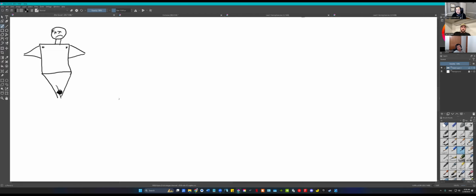So we're only looking at the limb leads now. As far as the machine is concerned, it actually maps it out into an equilateral triangle. Across the arms, this is actually lead 1. From right arm down to the leg, this is lead 2. To left arm down to the leg, this is lead 3.